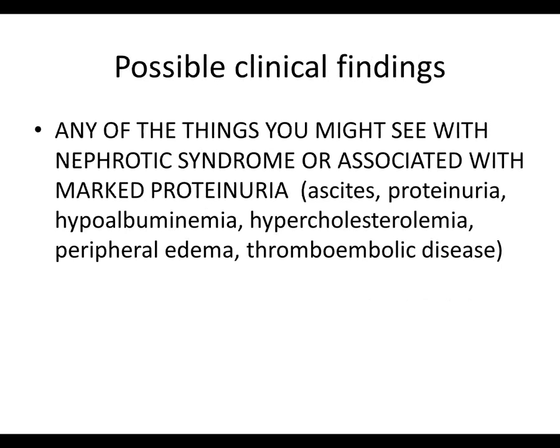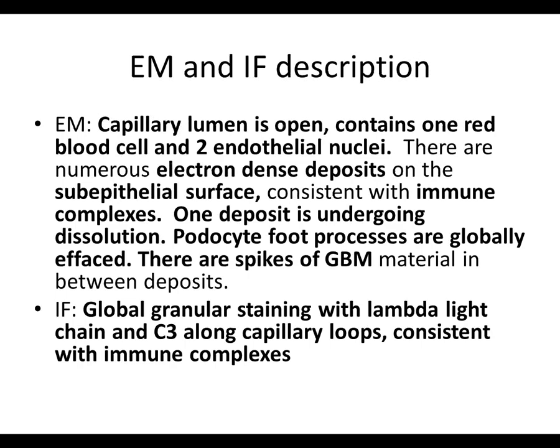Rachel, anything? Quick question, Rachel. On EM, I also was wondering about microvillus transformation. Would you call that? Yeah, we see that a lot. I think I didn't put it in my description. We just see it on so many things where podocytes are injured. But that would be another thing that is definitely there, and it's prominent in this case. So everybody saw the little cytoplasmic projections on the EM picture coming off the podocyte, and we see that a lot in podocyte injury. It's a very nonspecific change.